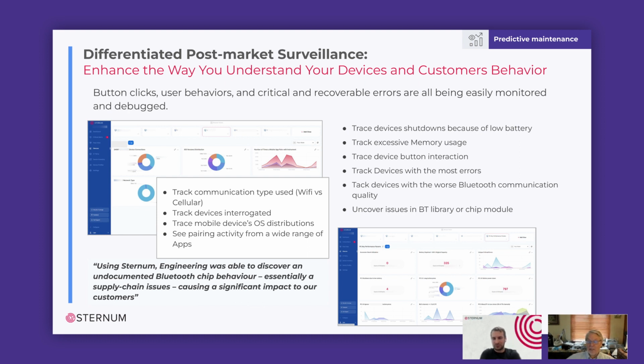We've seen button press times of 10 and 20 seconds where I'm imagining that somebody's just sitting there mashing on that button, wanting the thing to turn off, and it won't turn off. And so, that type of situation or that type of feedback can help us understand what kind of education and instruction to provide to the field on how to use this product. So it can help us, in short, then get insight into user confusion on our product.